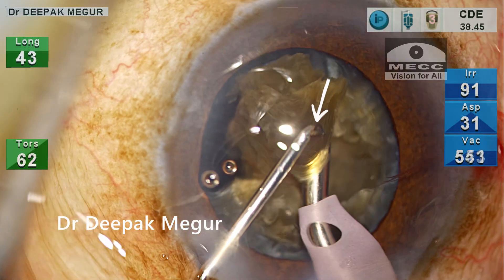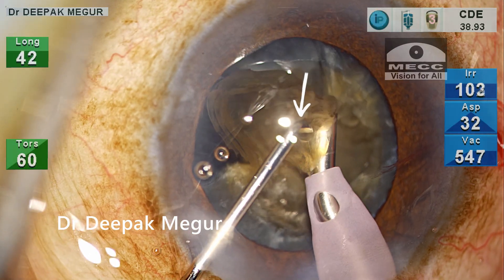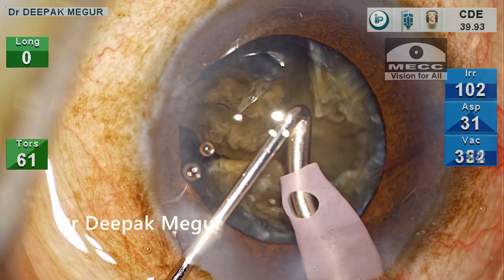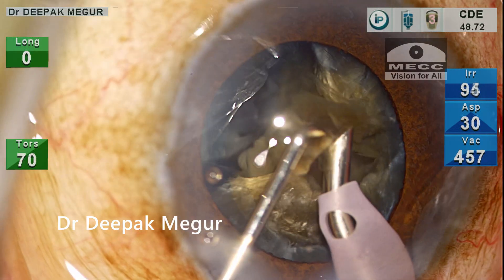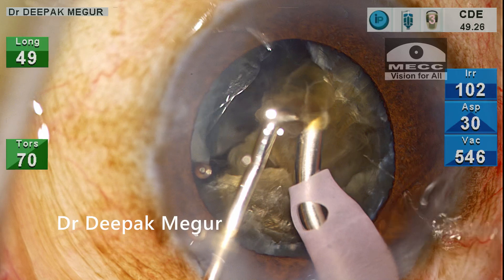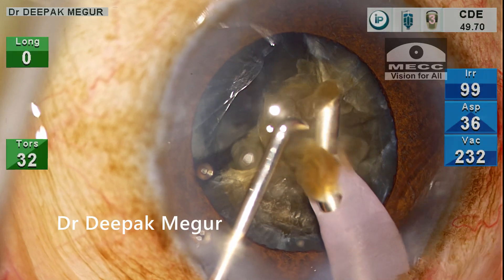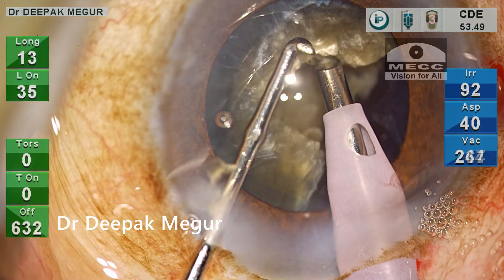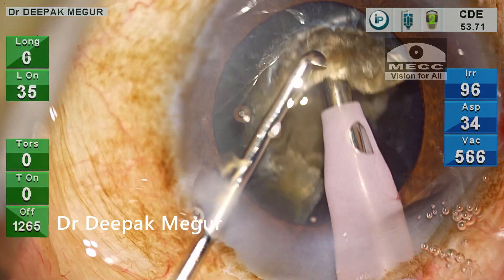The chopper on top of the fragment ensures that none of the fragments move up to hit the endothelium. There is one rare fragment that escapes but is quickly emulsified. The first piece is now emulsified and we continue to chop the remaining hemi-nucleus.